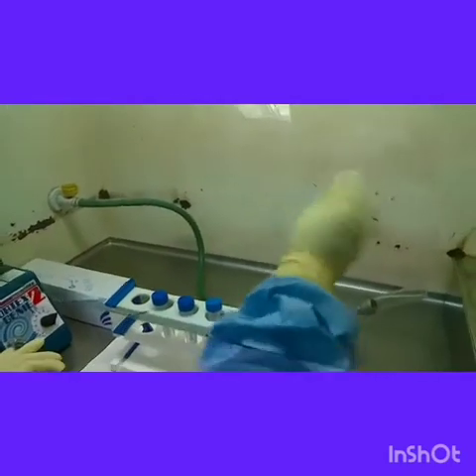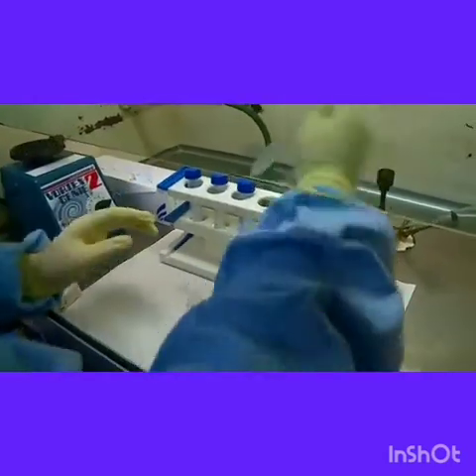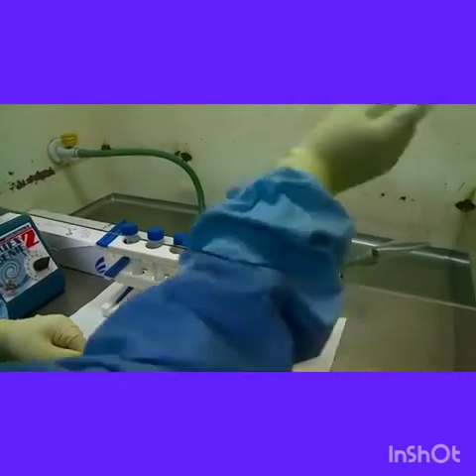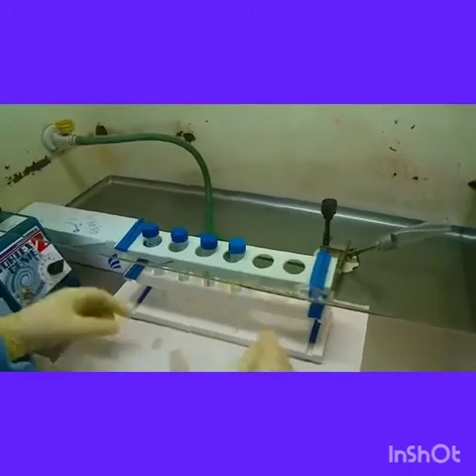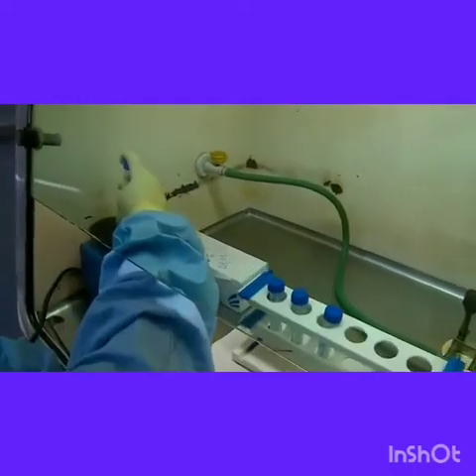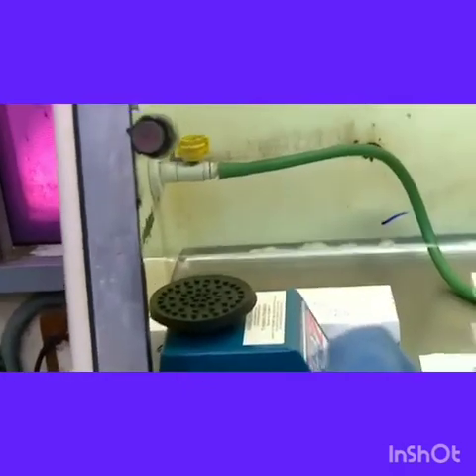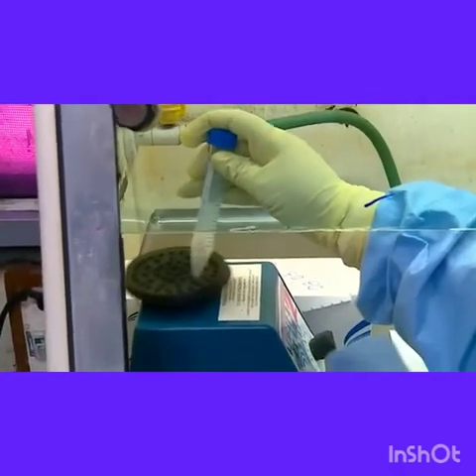Once the sample reagent is added, it is shaken vigorously to ensure complete homogenization and also to trap any mucus particle that is trapped at the bottom of the lid. Then the samples are vortexed vigorously to ensure uniform homogenization for about 30 seconds.